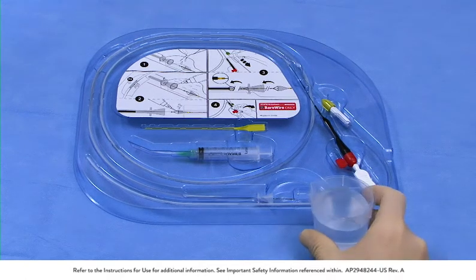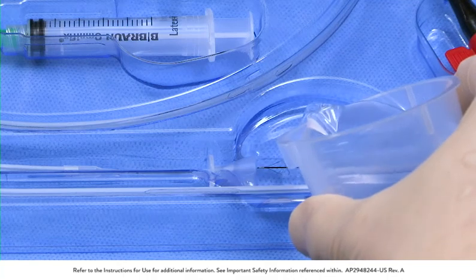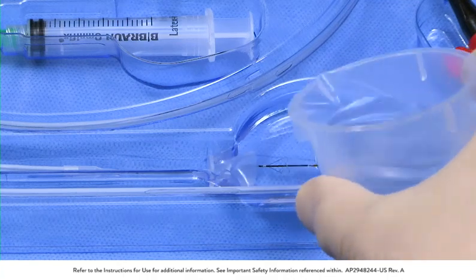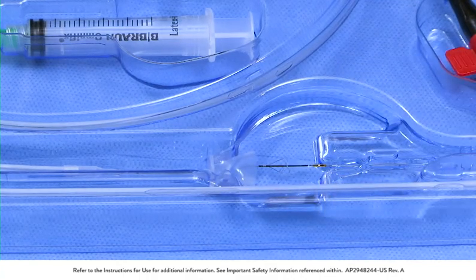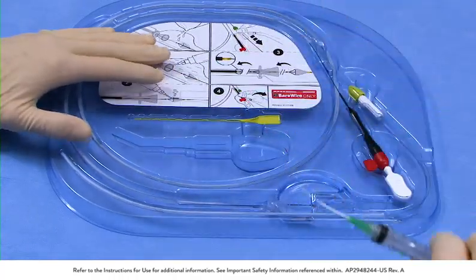Fill the recessed well area with heparinized normal saline until the filtration element is completely immersed. Fill the provided syringe with heparinized normal saline.